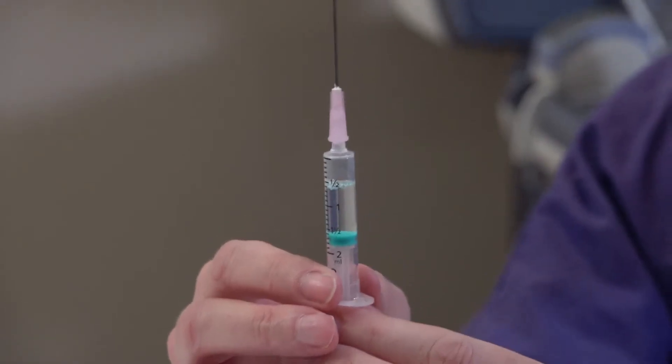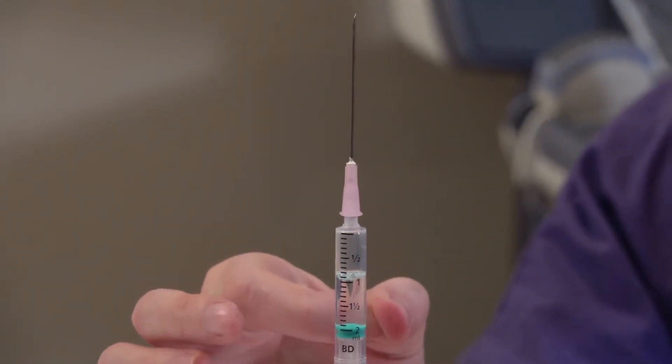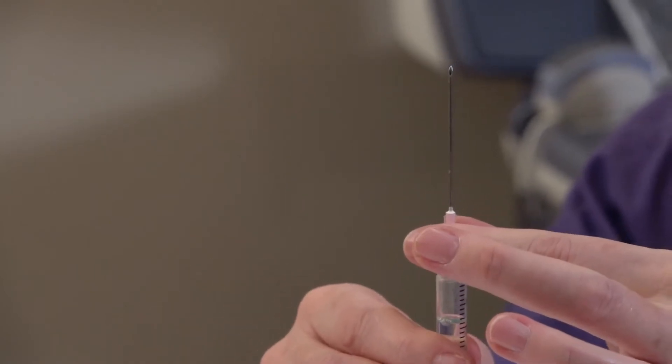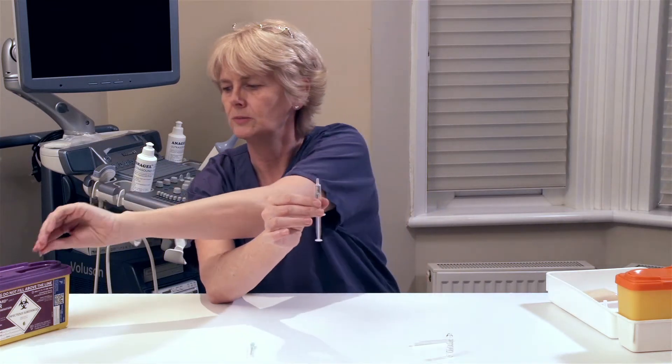Pull back slightly on the plunger, then tap the syringe so any air comes to the top of the fluid, and remove the drawing up needle. Place this into your sharps bin.